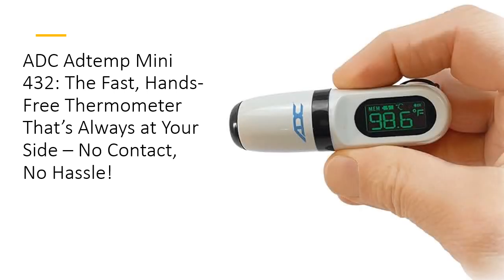Worried about tracking fever? The AddTemp Mini 432 does it for you. Its color-coded LCD display provides instant feedback — green for normal, yellow for elevated, and red for fever. An audible beep lets you know the reading is complete, so you can check temps quickly without disrupting your routine.